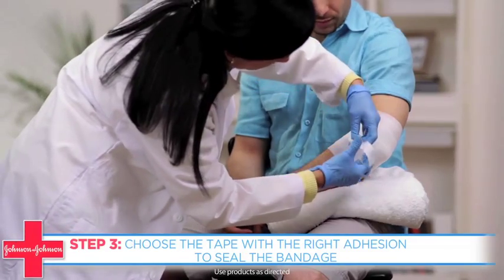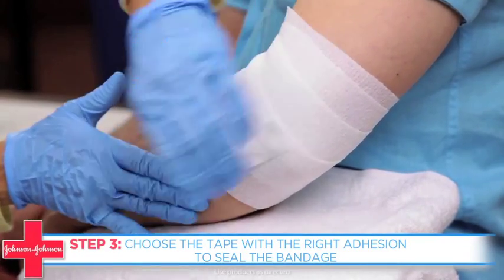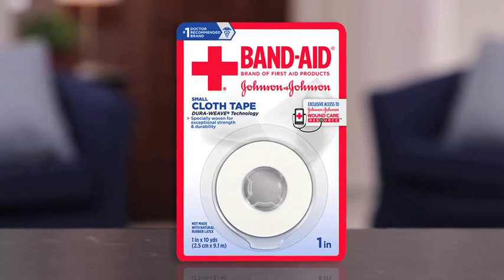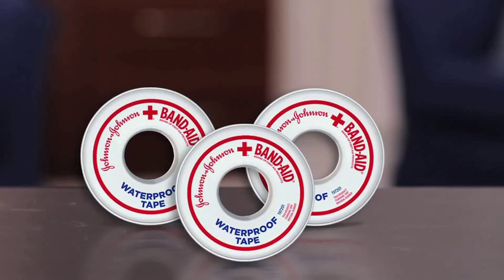Finally, choose the tape with the right adhesion to seal the bandage. There's latex-free paper tape that's gentle and easy to remove, Band-Aid brand First Aid cloth tape that's strong, durable, and breathable, or waterproof tape that stays on even when wet.